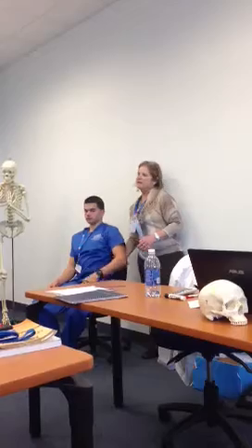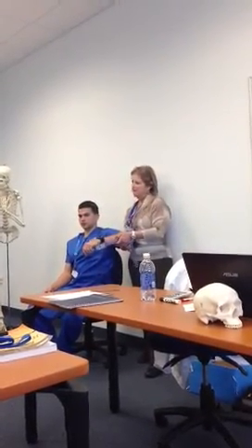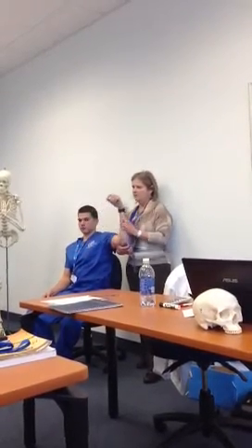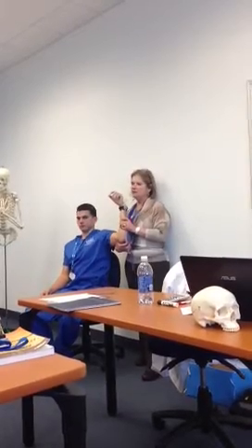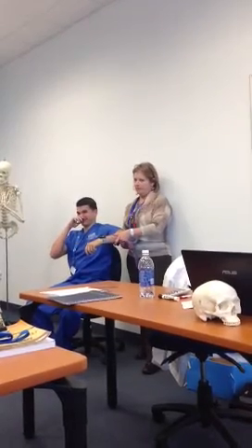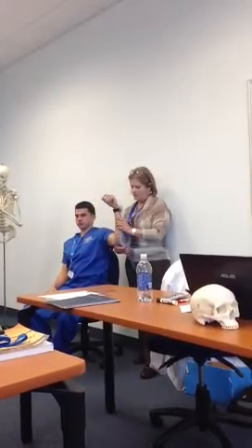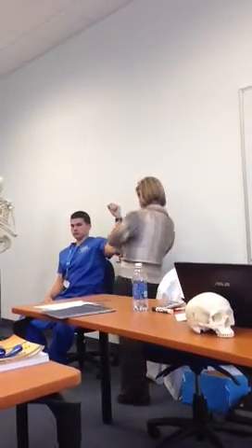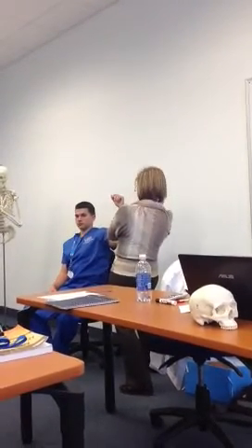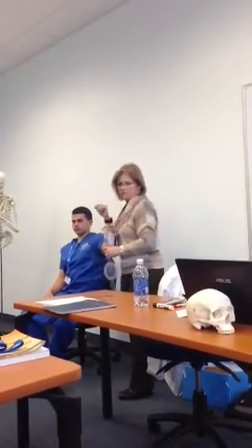So this is the only one in rotation that is a little different, you know, you put your goniometer here, you move it here. So it changed the plane and it changed the axis. So the angle is how much? In that case? How much is the angle? A little bit more than 90. 92? Normal.